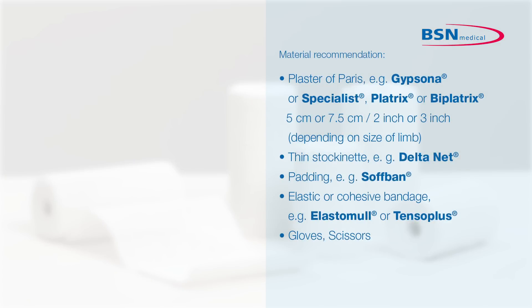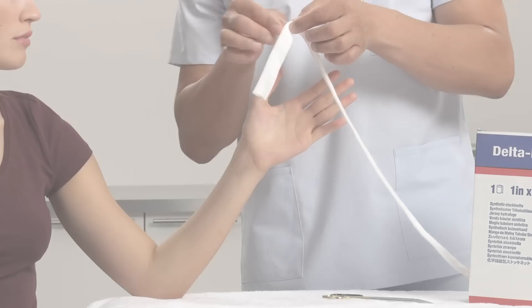Define the position of the limb before the start of application. Position the wrist in slight dorsal flexion and neutral ulnar radial deviation or slight supination. This will give the patient an indication of which position they have to maintain the limb.